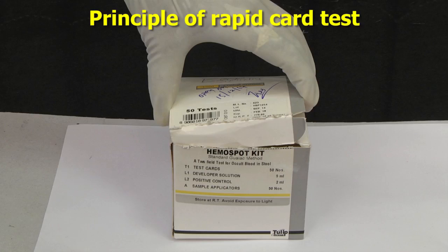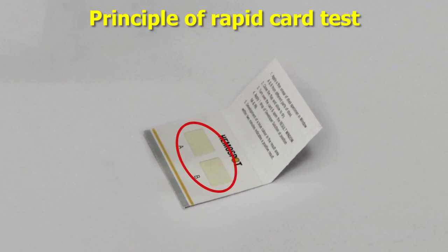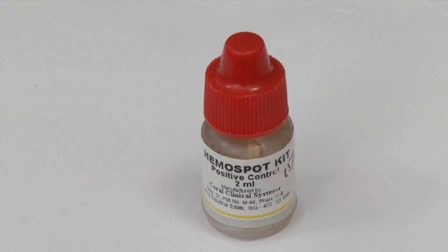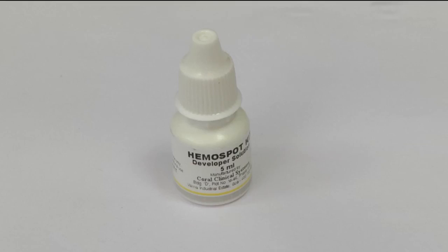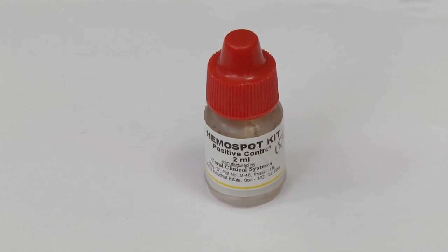Hemospot card test is a rapid card test available in the market for detection of fecal occult blood. Test cards consist of a filter paper impregnated with the guaiac resin on the reactive surface, a developer solution containing hydrogen peroxide, and a positive control. Contents of the kit: test cards, dropper bottle containing developer solution, sample applicators, positive control.